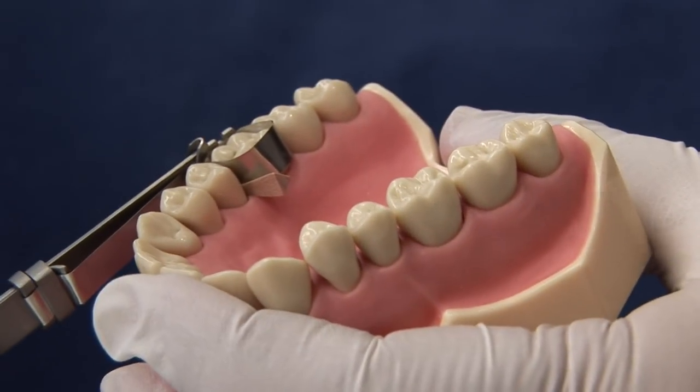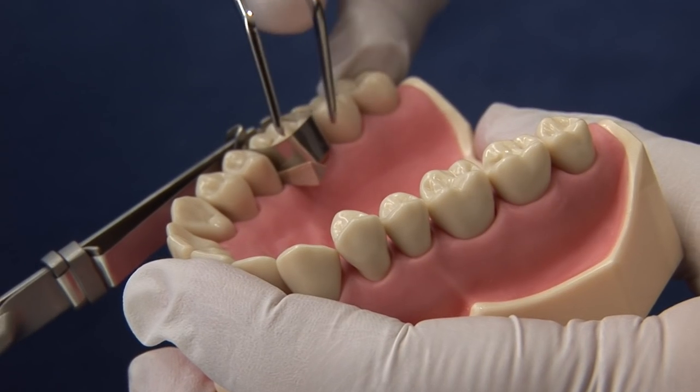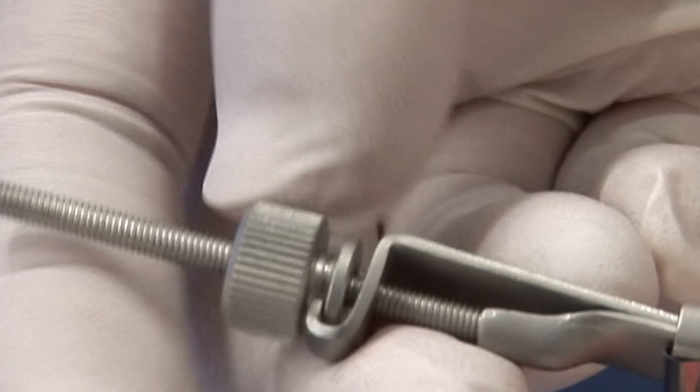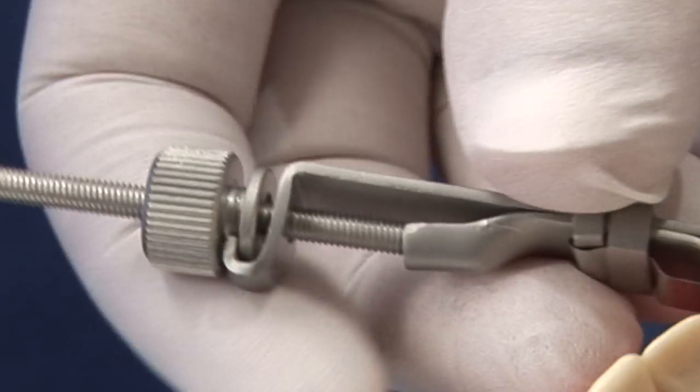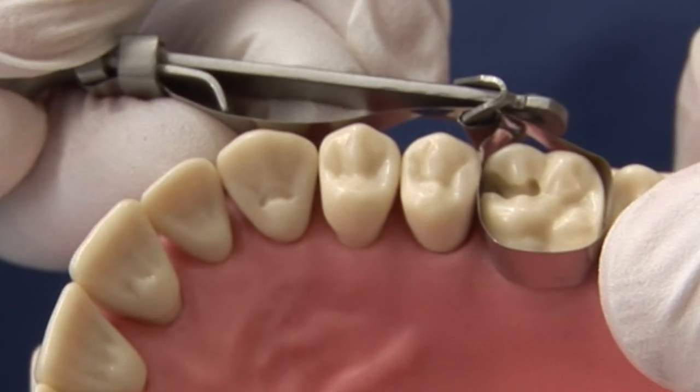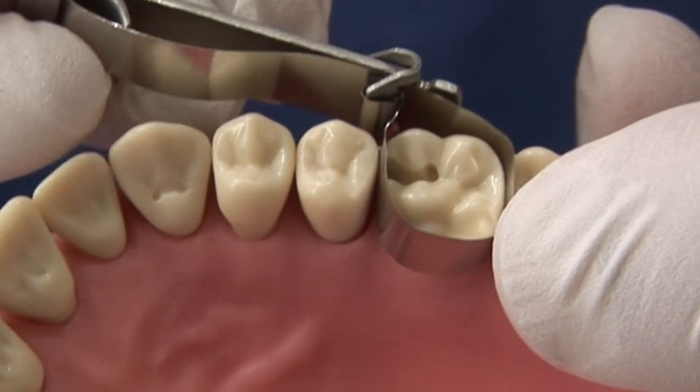To remove the matrix retainer, remove the wooden wedge. Unwind the nut and wriggle the matrix band away from the tooth.